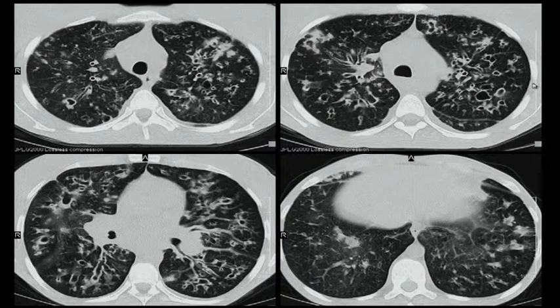Let's say we look at this particular cyst, okay? And you say, Dr. Chadha, this is a cyst. So I say, is it any cyst or is it a special type of cyst? You'll say, oh, this is not just any cyst. It's actually a dilated bronchiole. Why? Because it has an adjacent pulmonary artery next to it. So this combination of a donut with a ring is also sometimes called a ring that you wear on your finger, this being the stone and this being the ring. This is the signet ring sign. That just tells us that the pulmonary artery travels with the bronchiole.